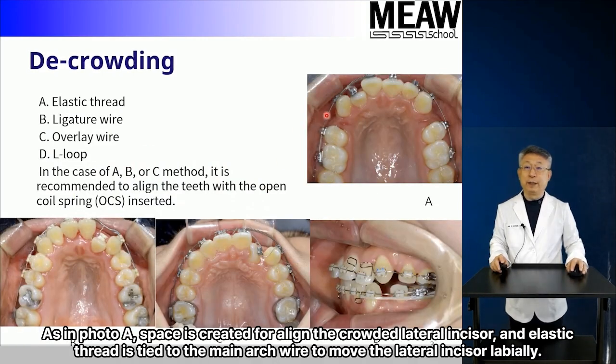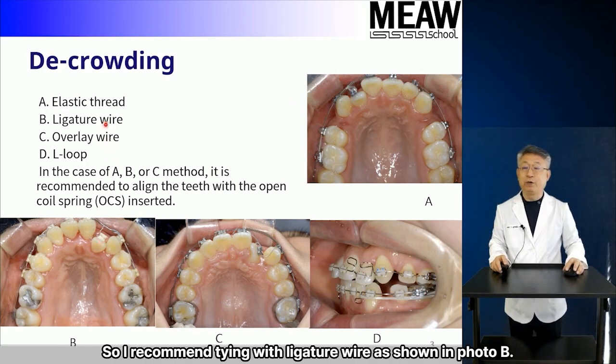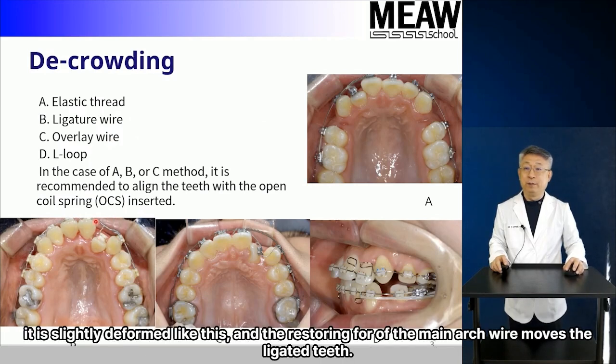As in Photo A, space is created to align the crowded lateral incisor, and elastic thread is tied to the main arch wire to move the lateral incisor labially. The problem with the elastic thread is that it tends to loosen during tying. So I recommend tying with ligature wire as shown in Photo B. When ligature wire is tied to the main arch wire, it is slightly deformed like this, and the restoring force of the main arch wire moves the ligated teeth.